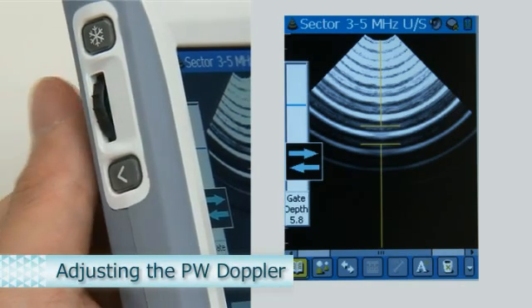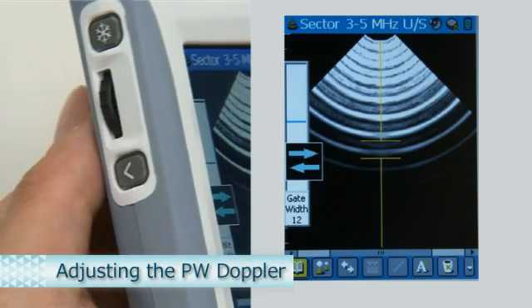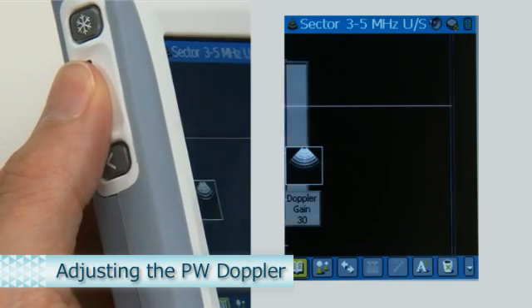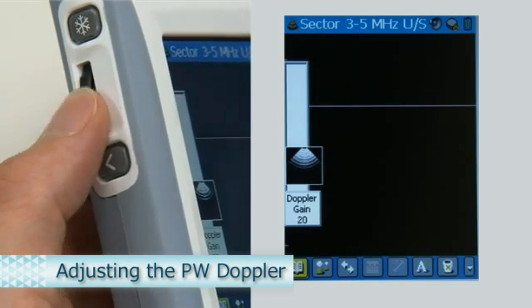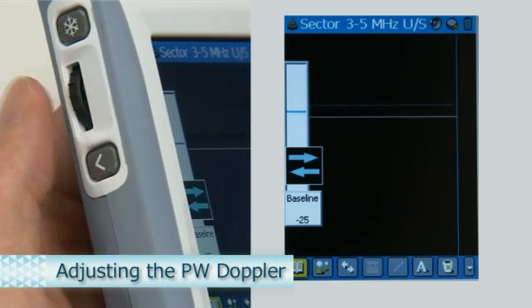PW Doppler mode enables adjustment of the position and width of the sample point. When the PW Doppler waveform is displayed, the Doppler gain, baseline, and PRF can be adjusted.